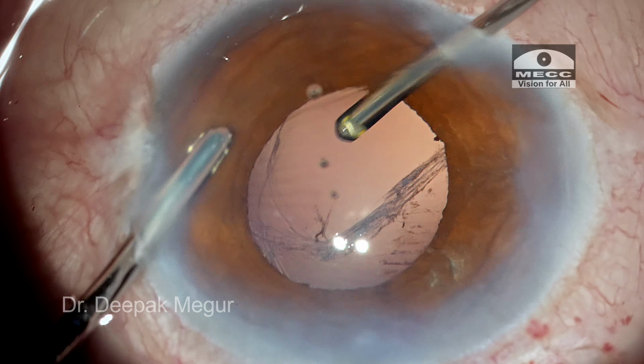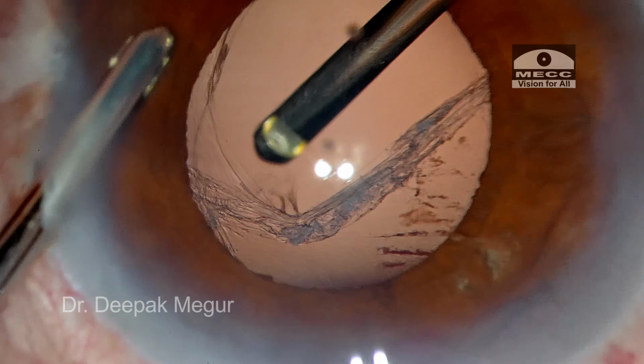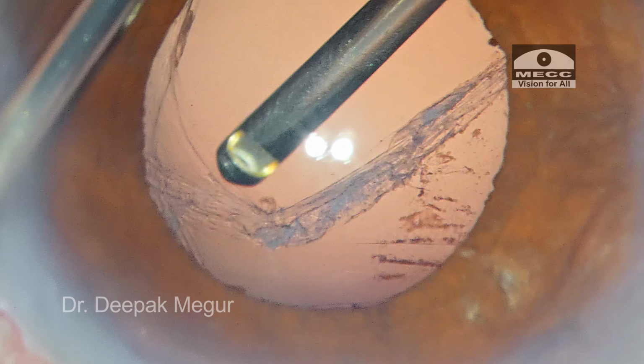It takes a couple of minutes to complete the vitrectomy. And finally, the strands which are near the apical region are identified in high magnification and are dealt with. So now it seems that the vitrectomy is adequate.